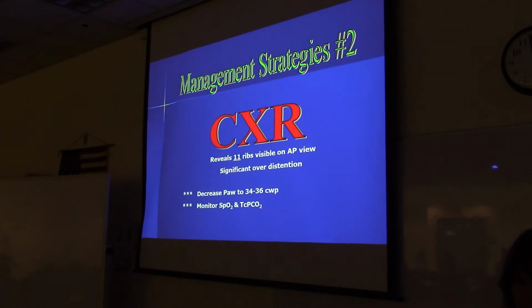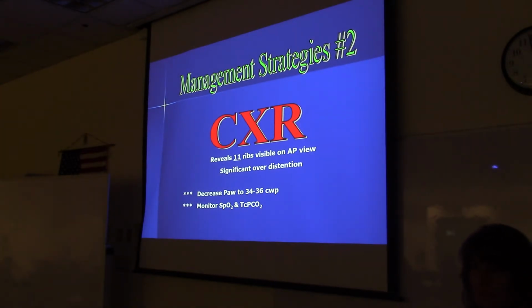What would be considered too much MAP? Would we determine that on how the patient is, because everyone's so different?